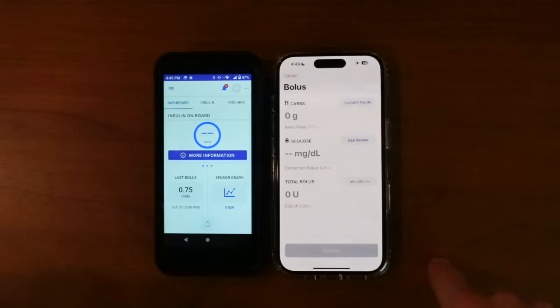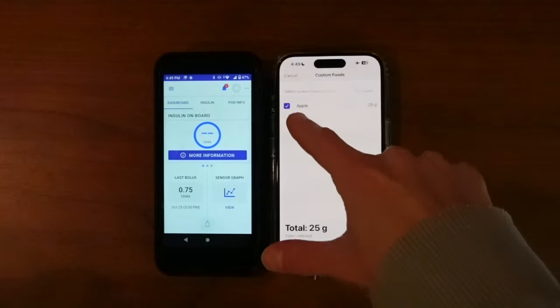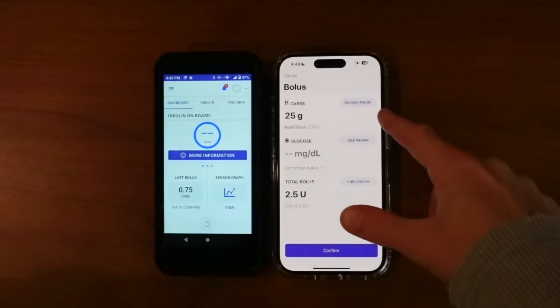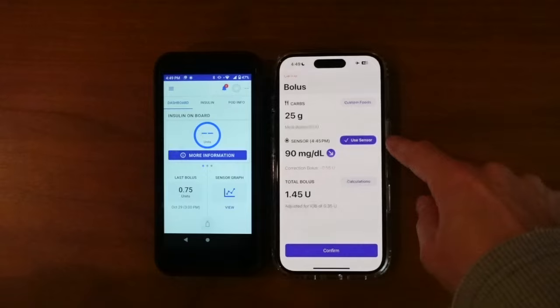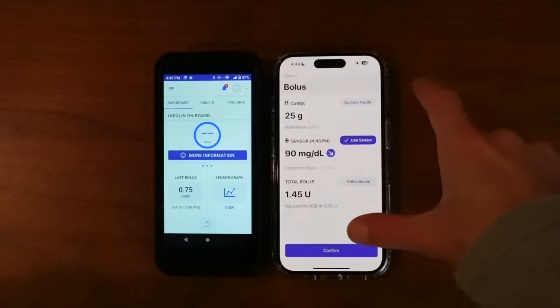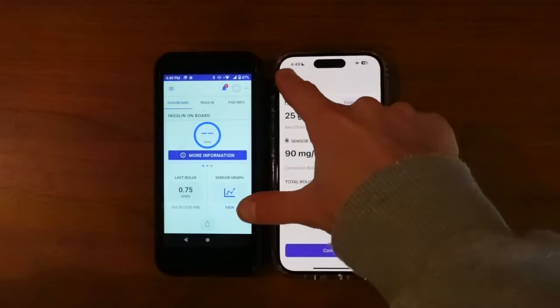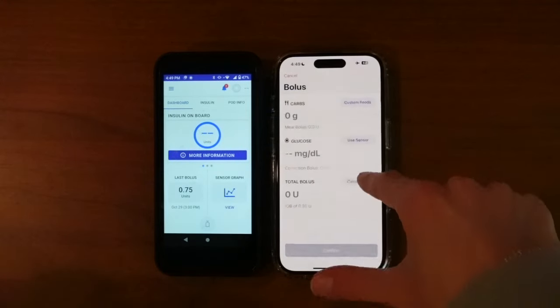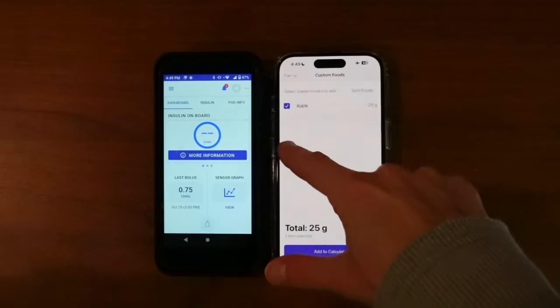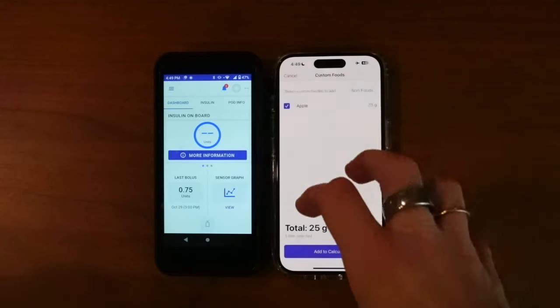And the custom foods will show up right there, and I can just click Apple. That automatically gets added to the calculator — 25 grams. Use sensor, there are my calculations. You can't unclick a food item, so you would have to cancel and come back in if you wanted to remove the carbs. But you can see over time, as this list gets populated, you'll be able to click multiple items, which is going to be very interesting to be able to feed that calculator.